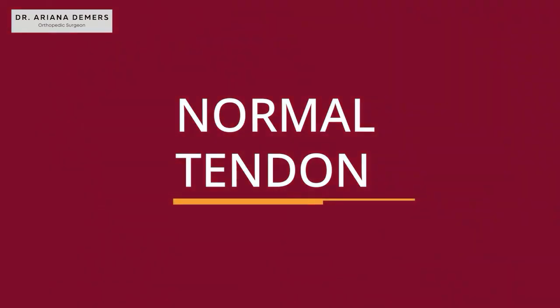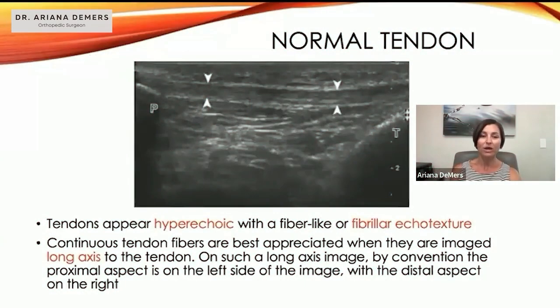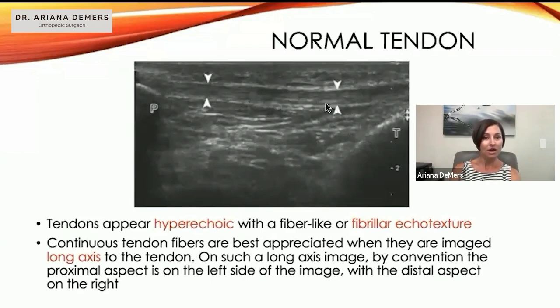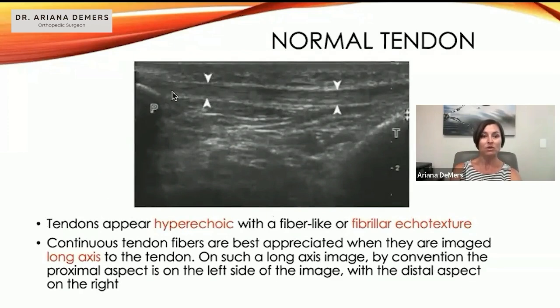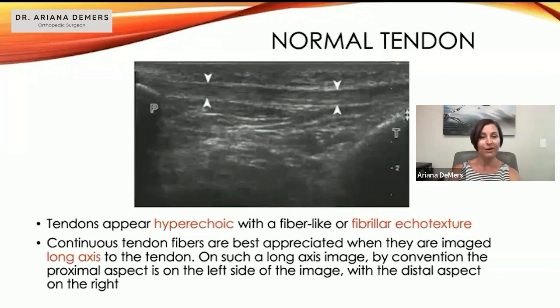We'll explain the echotexture as well as the echogenicity. This is normal tendon — along the arrows, this is actually the patellar tendon — and it's hyperechoic, meaning a little bit brighter white, with a fibrillar echotexture showing densely packed fibers. Tendon goes from bone to muscle, but the patellar tendon actually goes from bone to bone, so calling it a patellar ligament may be more proper.